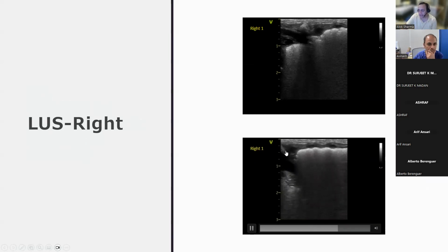What is happening is I'm not getting very good delineation. What I can say is I can't see an established pleural line at all, and I can see this area of what I would say is consolidation with absence of the pleural line. That's not fluid.